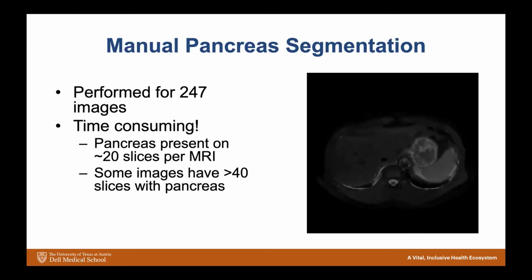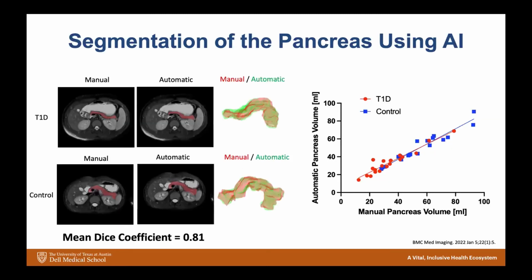It's too much work if we're thinking about making this into a tool that we could apply to really huge data sets. And so one of the things I've been working on, and many others in the medical imaging field have been working on now for decades, is, well, can we train computer algorithms to automatically segment different organs? And these have really taken off, I would say, within the last 5 or 10 years, between advancements in deep learning, UNets, and what we've found is that they can do a pretty good job now.